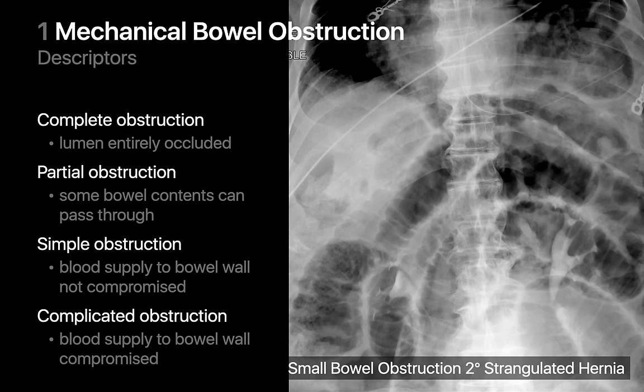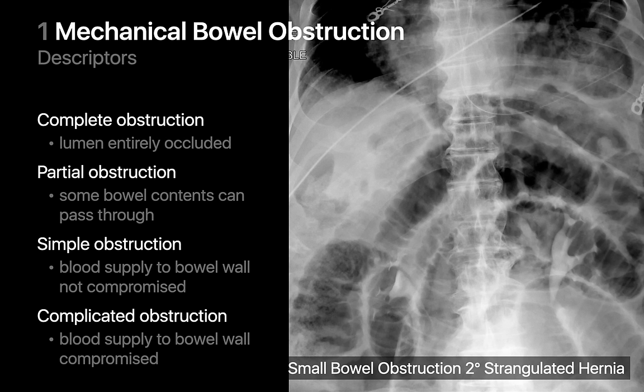A closed loop bowel obstruction results in multiple gas-filled segments of distended small bowel upstream and thickening of the valvulae conniventes, plainly visible on this abdominal x-ray. The stomach in this case is not dilated since it's being decompressed by a nasogastric tube.